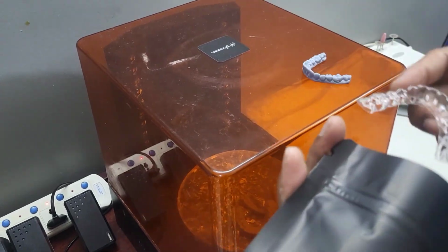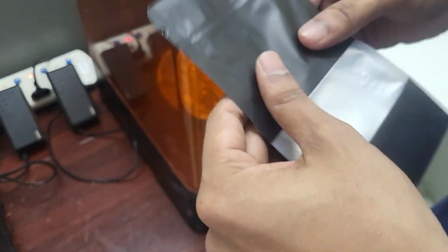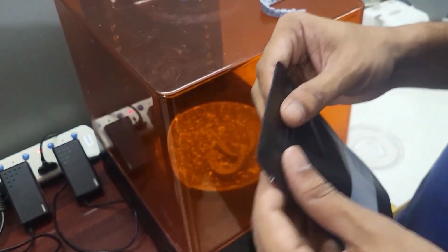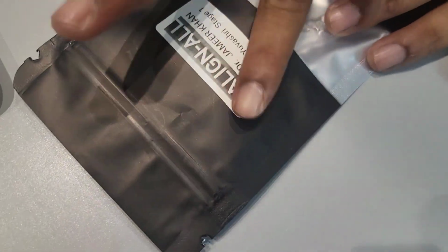And the stage 1 aligner has been completed. Now we are going to pack the aligner into the packet, and then we have to label it. And finally our in-house aligner fabrication is completed, ready for inserting in the patient's mouth.